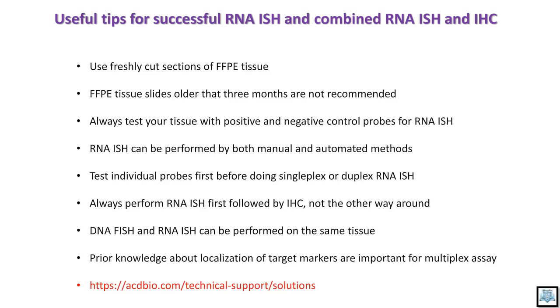So in our laboratory, we have actually used the Ventana Discovery XT, the research instrument for performing RNA in situ hybridization. And the other important thing that I would like to mention is, if you are planning to do both IHC and RNA-ISH to detect more than one target in the tissue of your interest, I would recommend testing both your antibody and the individual RNA-ISH probe first individually, to make sure they are performing well before combining them.